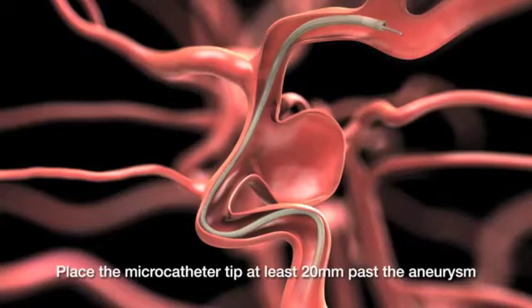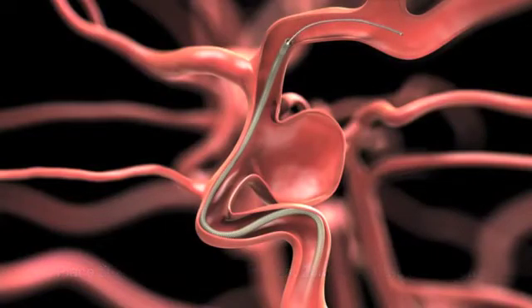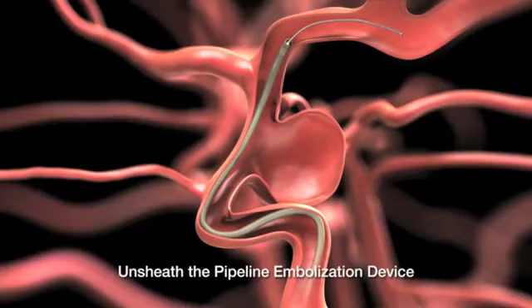It's brought up through the microcatheter and then unsheathed across the neck of the aneurysm within the parent artery, which in this case is the intracranial carotid artery.